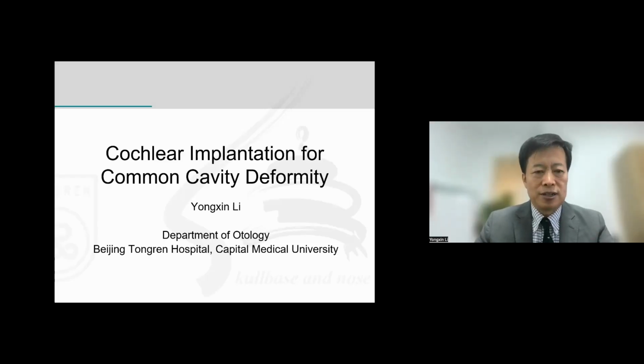Thank you for inviting me to share my experiences with international doctors. I have the great honor to do this. Today my topic is cochlear implant for common cavity deformity.